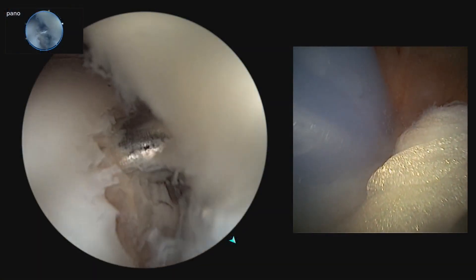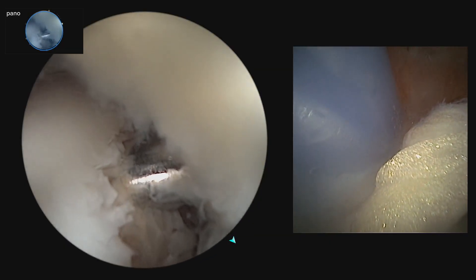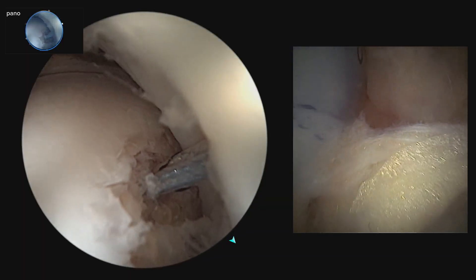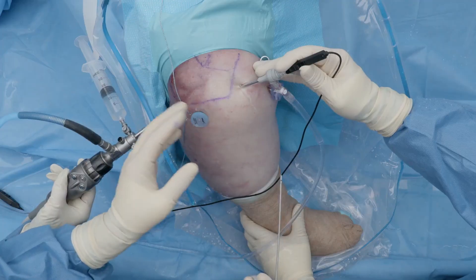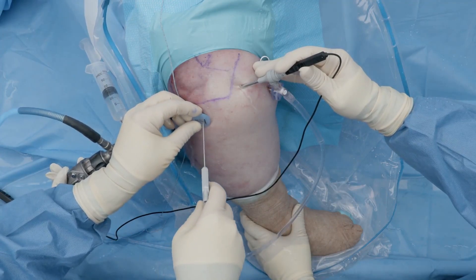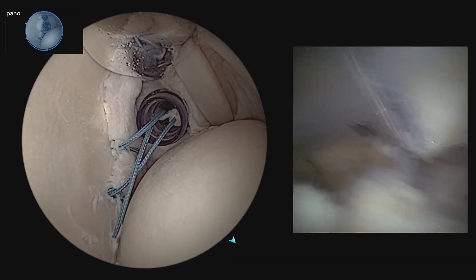Now that we have confirmed that our anchors are in good position and can see the sheaths in the subacromial space with the nanoneedle, we remove the sheaths to show our sutures and begin the convergence of the two anchors. Concentrating on the nanoneedle in subacromial space, we retrieve the repair suture from the inferior anchor and the loop suture from the superior anchor to start completing our convergence.